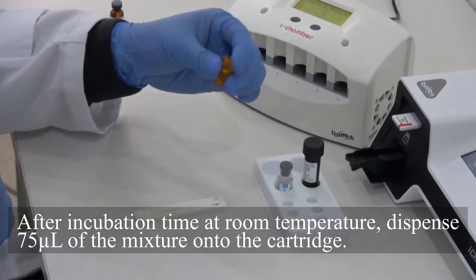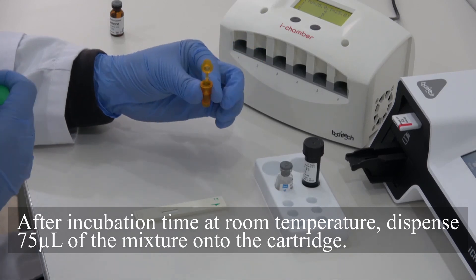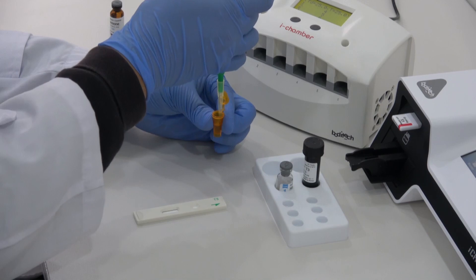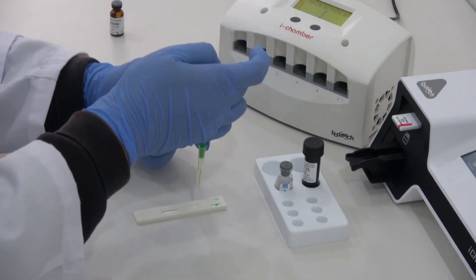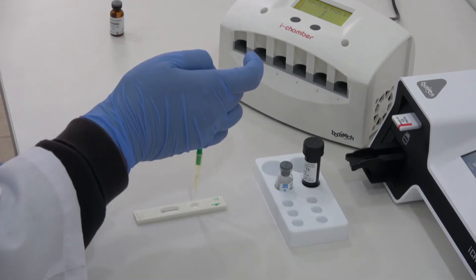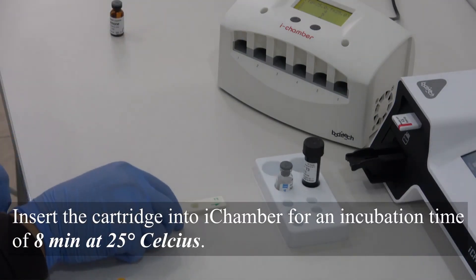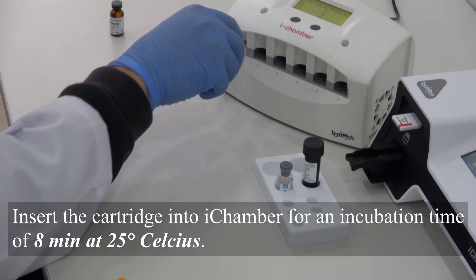After incubation time at room temperature, dispense 75 µL of the mixture onto the cartridge. Insert the cartridge into iChamber for an incubation time of 8 minutes at 25 degrees Celsius.